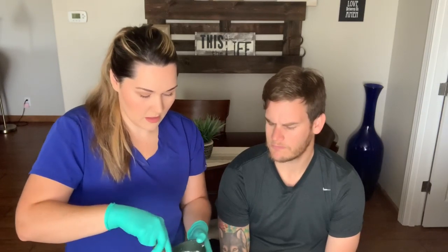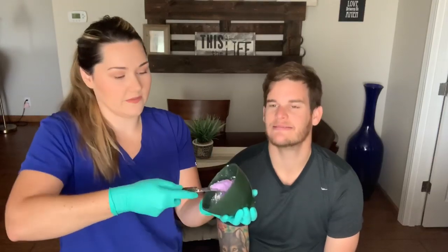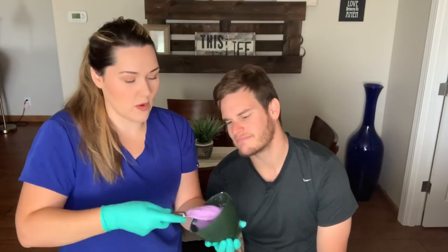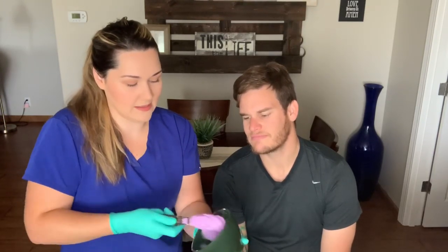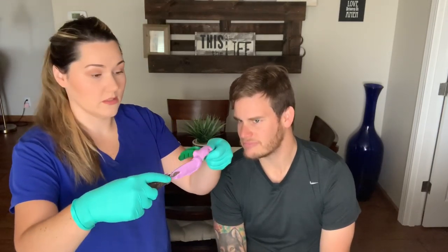Make sure when doing this in office you're wearing safety goggles, mask, and all that. So you have a bowl full of alginate — pour your cold water in and mix it up fairly quickly. It's almost like mixing cake batter; you're flipping it like this. This one is a purple color and it turns clear or white when it's set inside the mouth. Make sure all the lumps are out, basically like a brownie mix.